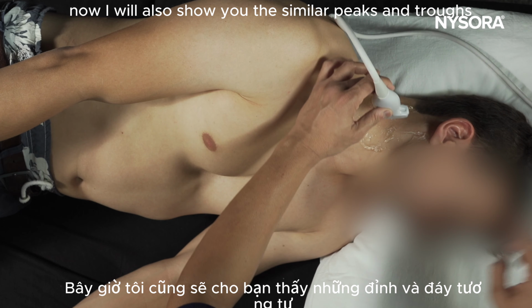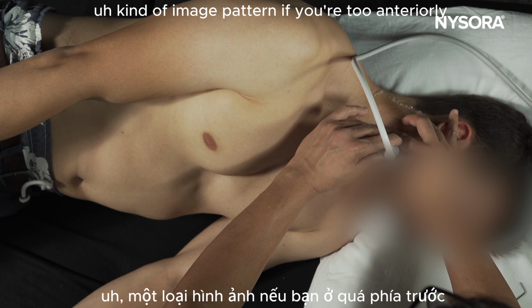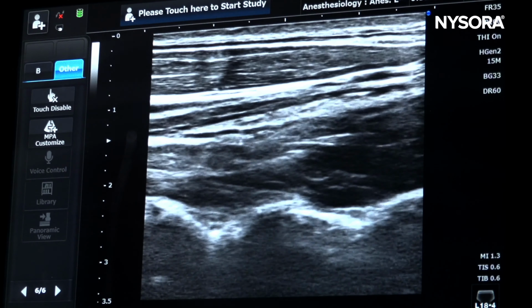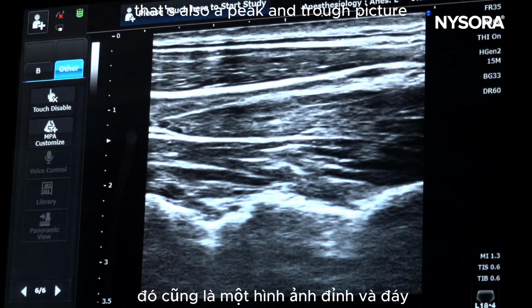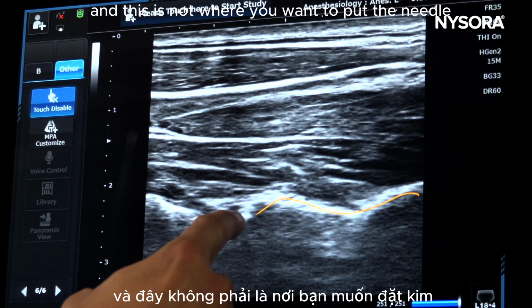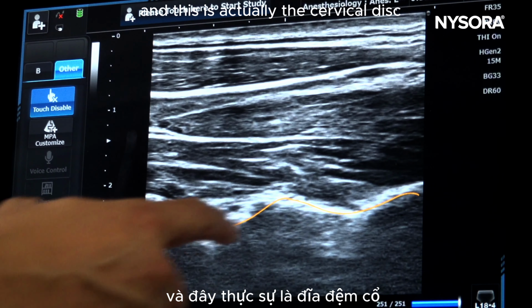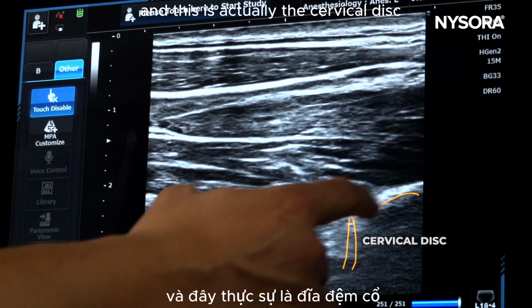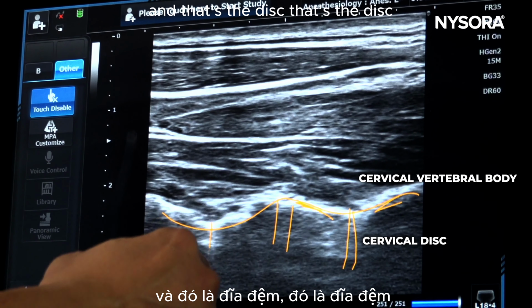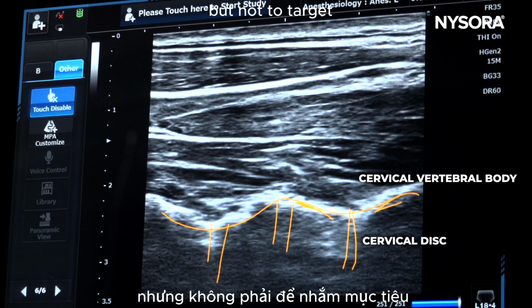Now I will also show you a similar peaks and troughs kind of image pattern if you're too anterior. And now you can see in this particular image here, that's also a peak and trough picture like the one we saw for the facet joint column. And this is not where you want to put the needle, because we're way too anterior, and this is actually the cervical disc along with the cervical vertebra. So this is a vertebral body, and that's the disc, that's the disc. So this is basically a picture that you want to see but not to target.